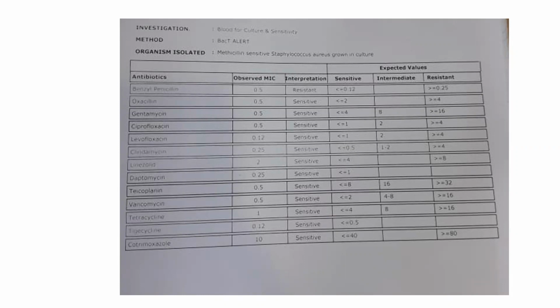As bacterial growth happens, the bacteria use the media and produce carbon dioxide through metabolism. Once the carbon dioxide reaches a threshold in that bottle, the machine identifies it as a signal, and we say it's flagging. It gives a signal, or a light blinks. So the lab technician or the microbiologist knows there is a threshold level of bacteria growing, and then they take out the tube.